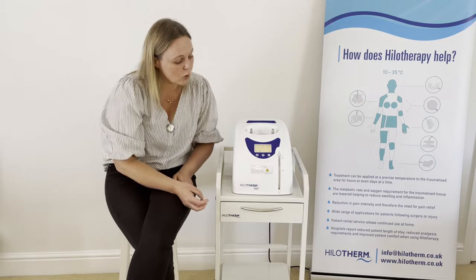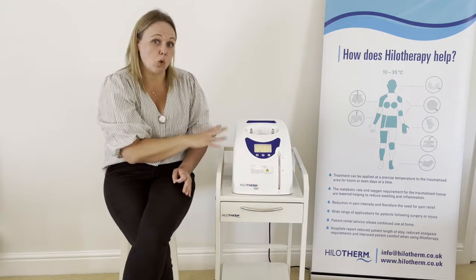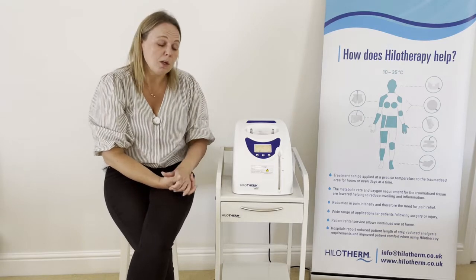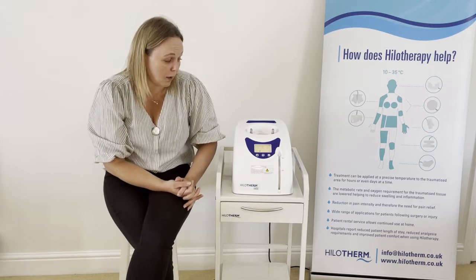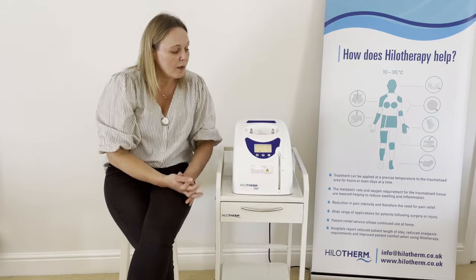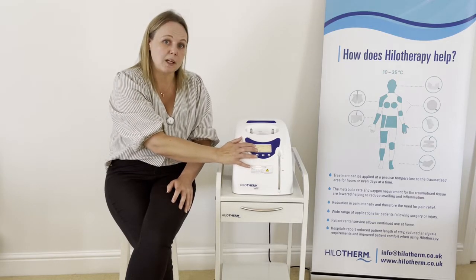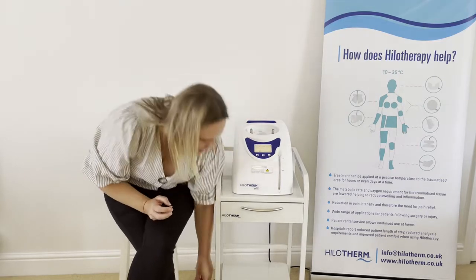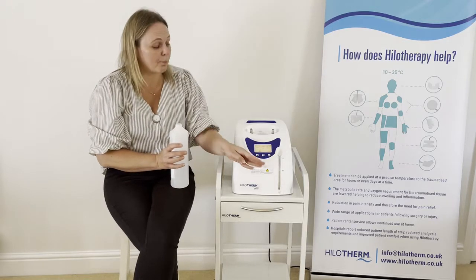As mentioned, the unit contains two litres of either sterile or distilled water, so you don't need to do anything with the water in the machine routinely. The water needs to be changed at least every six months and we do have a water change protocol available. If you want a copy, please contact us. Otherwise, if the device alarms and says 'error water level', you need to top up.